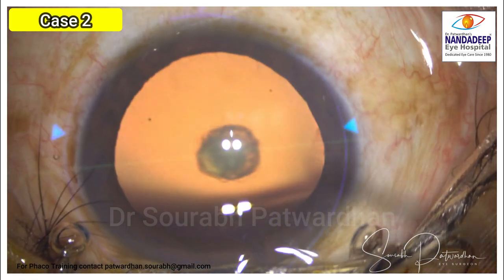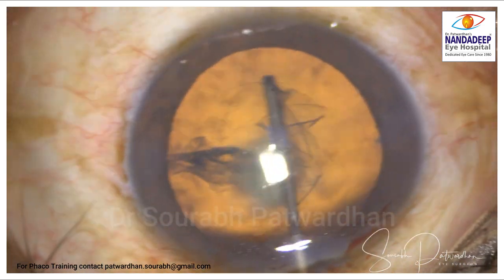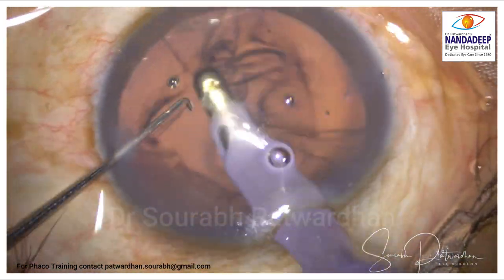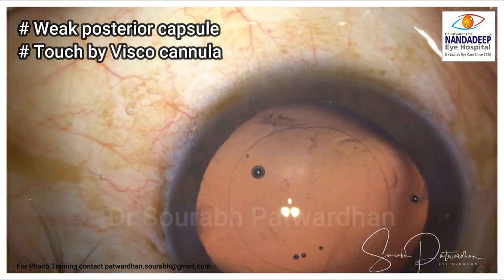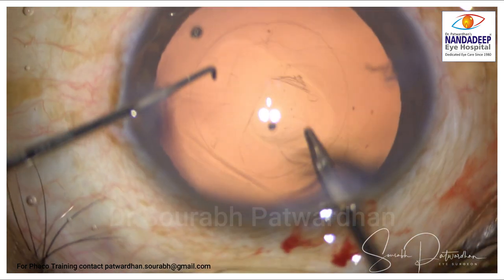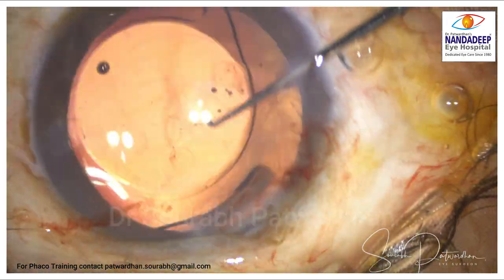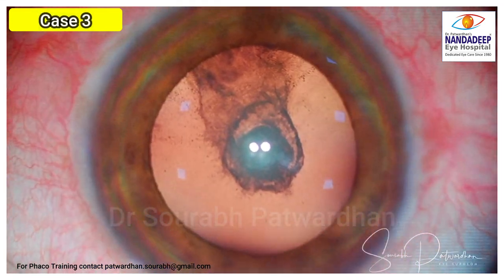Case two looks like a posterior subcapsular cataract; there are a few areas where the margins are more demarcated, but I assumed this was a posterior subcapsular cataract again and took no specific precautions like posterior polar. The surgery went uneventful, cortex was removed, but when I was about to inject the viscoelastic the posterior capsule opened up. I am not sure whether it was a weak posterior capsule or a touch by the visco cannula, but in most cases the touch of the visco cannula should not open the posterior capsule, so I assume there was some weakness of the posterior capsule. I converted it into a posterior CCC and managed the case well.